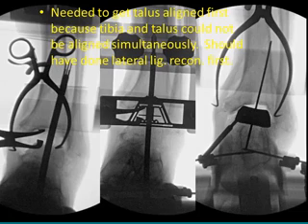In the mortise view and the lateral view. Now, with the INBONE at the time of surgery for these big-time deformities, you can either do the ligament reconstruction right at the beginning, and then you're able to balance the tibia and the talus simultaneously and make the cuts, or you can do what I've done here, and that is to put the guide and the drill into the calcaneus and the talus, and then rotate the foot around before I drill up into the tibia.